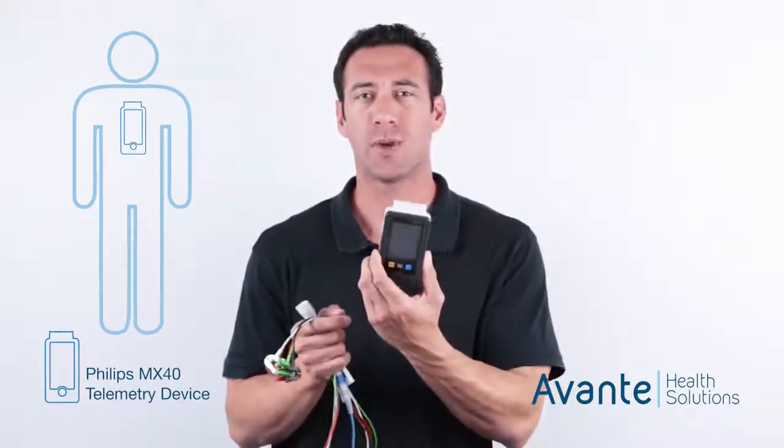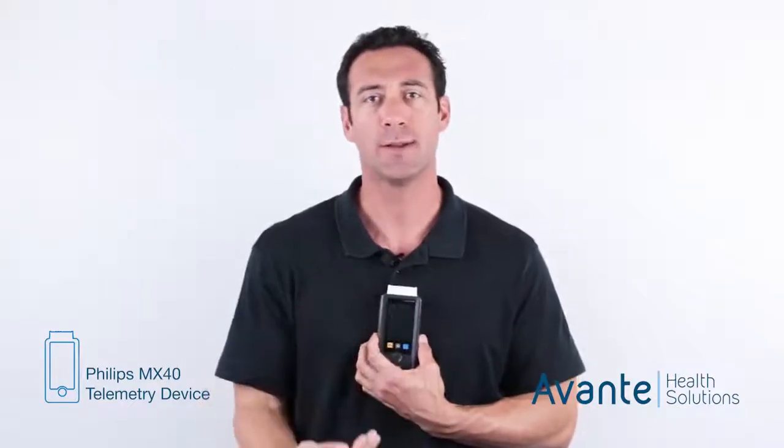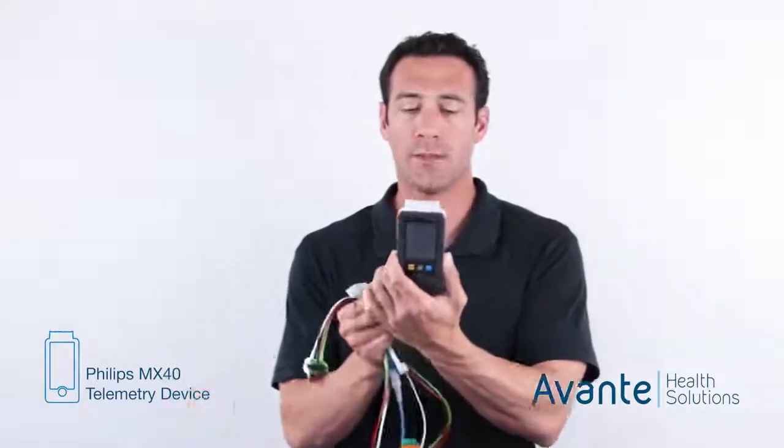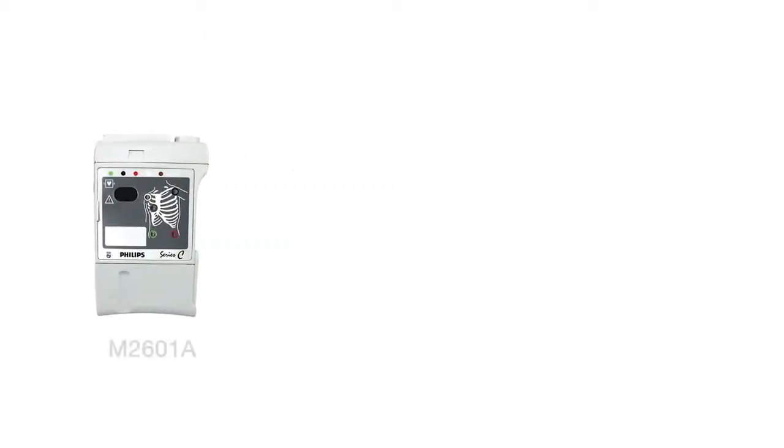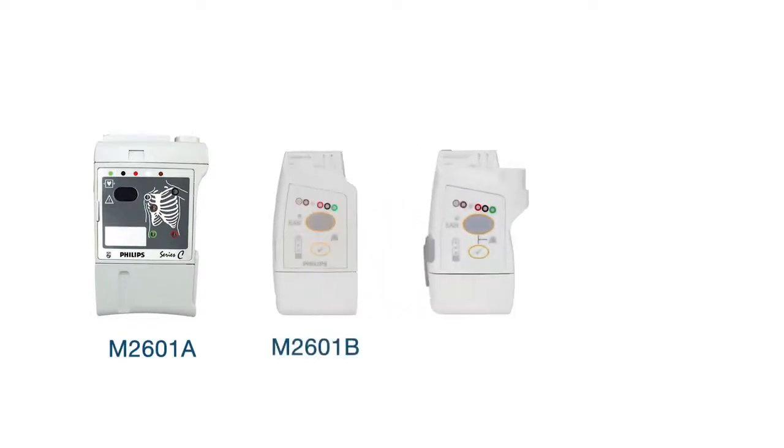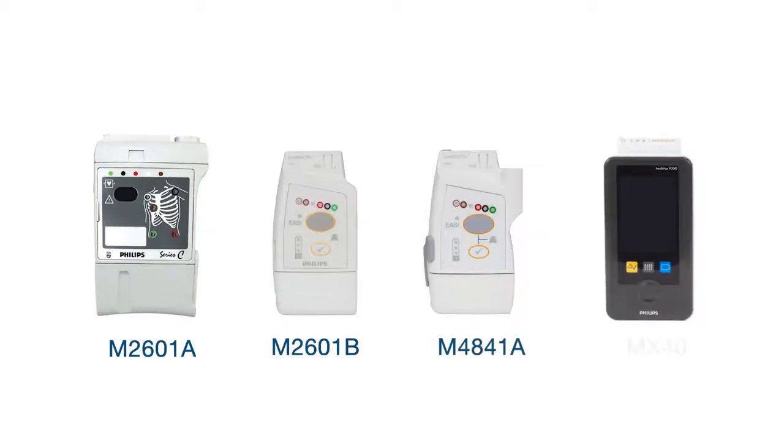Because it has that screen, this is one of the few telemetry products that's known as a patient-worn monitor, because now we can actually monitor vital signs right there on the patient and see what's happening. This will be mostly considered a telemetry device, however. So along with the predecessors to this product, you have the M2601A, the M2601B, the M4841, and then you have the most current, the MX40.